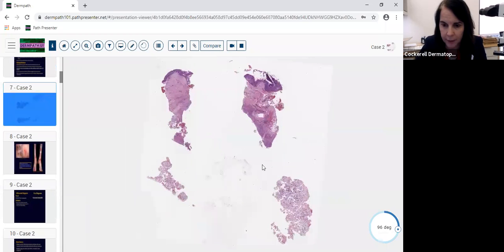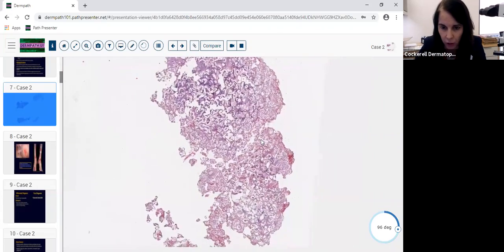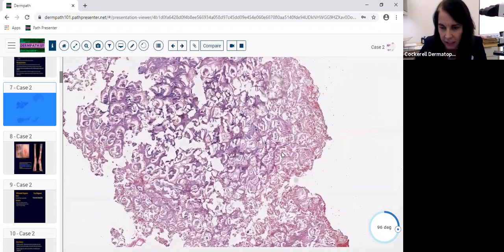we have a punch biopsy that's somewhat fragmented here. Right away, we notice the area down here where we have fat, or what was left of the fat. Our eye is immediately drawn to this area. And we notice that the lipocytes are gone. We have eosinophilic areas, but we also have basophilic areas over here and here. And this is where the free fatty acids in this entity basically take up the calcium salts, and you get these very characteristic basophilic areas in this lesion.